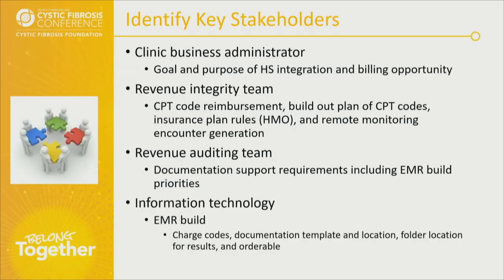So yes, you absolutely need to have the right stakeholders involved at the table when you make your decision to set up your program. The first person you want to talk to is your clinic business administrator. As you know, our revenue certainly was reduced from telemedicine, right? So we had to make that up. And we made this up through talking to our administrator, saying, hey, this is a revenue opportunity. We're getting the devices free from the foundation. We need to get on this. And he was like, yeah, we need to do this. So he really bought in because he was really invested in making sure that we could make up some of the revenue that we had lost.